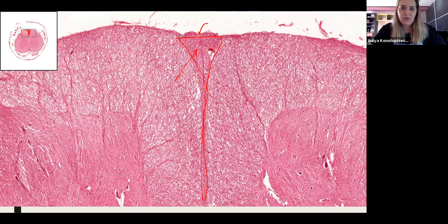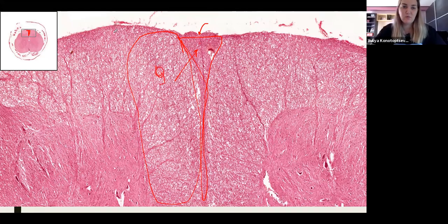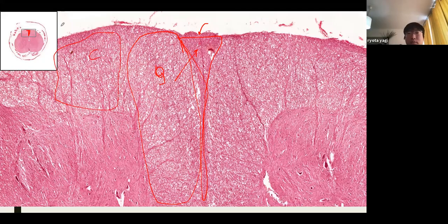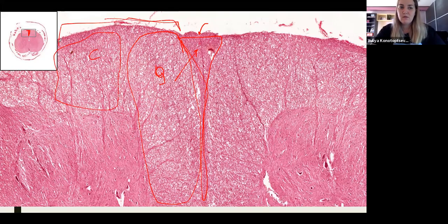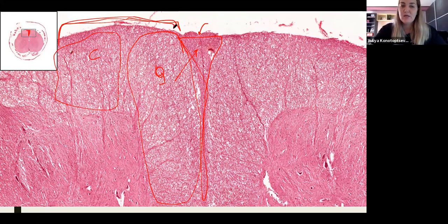So the axons that you see here, they do not possess as much myelin. How do you call this area right here? The fasciculus gracilis. Very good. Fasciculus gracilis, and the one right next to it? Cuneatus. Together they are known as? The dorsal column. Posterior column or dorsal column tract. You remember that this tract is the major sensory tract there is, right? So this is the one which carries most of the sensory information all the way to the brain.